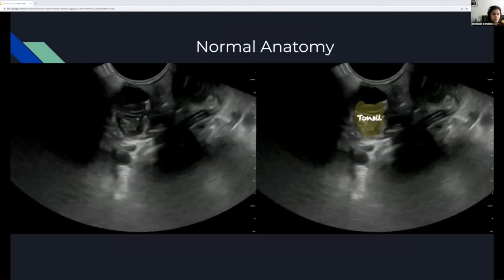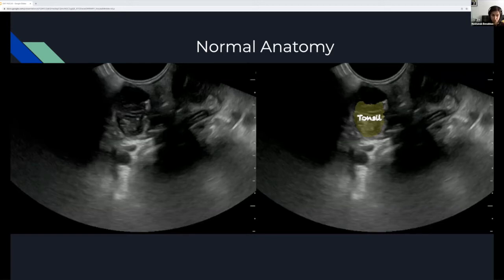The closest thing to your probe is going to be your tonsil, because you're placing your probe directly on the tonsil. This is a normal tonsil — there's no abscess here. The structure has a hyperechoic band in the middle, a slightly hypoechoic margin, and a hypoechoic parenchyma. That is how a normal tonsil looks on ultrasound.